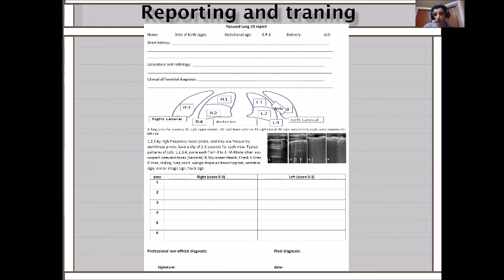What we do is a mapping of the chest, put it on the ultrasound, and it shows you 3D of the lung. They have one in the ICU, I believe. In the ICU, they have one 3D machine, but the rest of them are all 2D. The difference between 3D and 2D is the software. If it's a good ROM, or read-only memory, they will have software to grab all the pictures, and it tells you the direction, and then it reconstructs and gives you a 3D picture. It's exactly like a 3D CT scan.